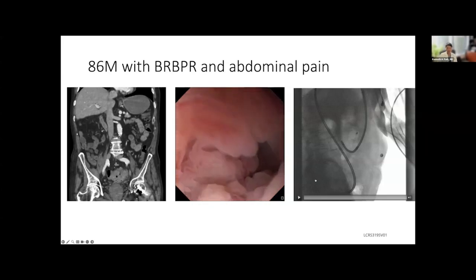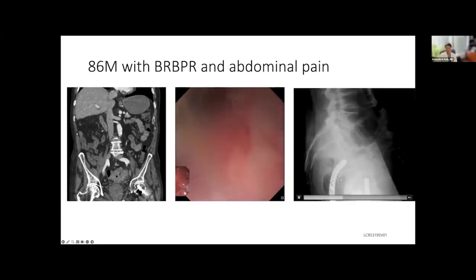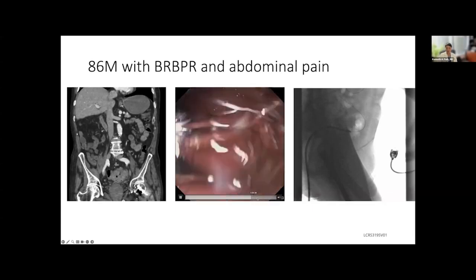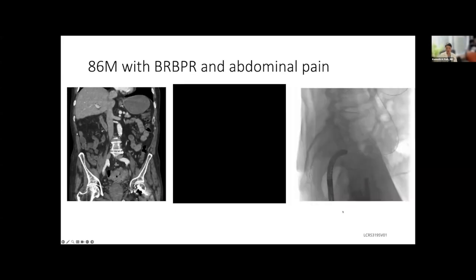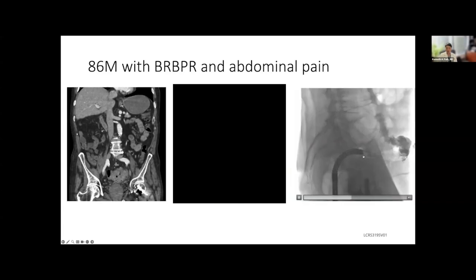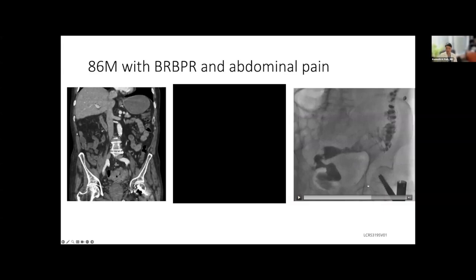Too tight to pass through with an adult colonoscope, and similar to what we used in the esophagus, we're using wires and different techniques to get through. And then here we placed a very stiff wire. This is what it looks like right after the tumor, as we traverse the tumor. Left the wire, and then we're exchanging. And here, you're placing stents from distal to proximal.